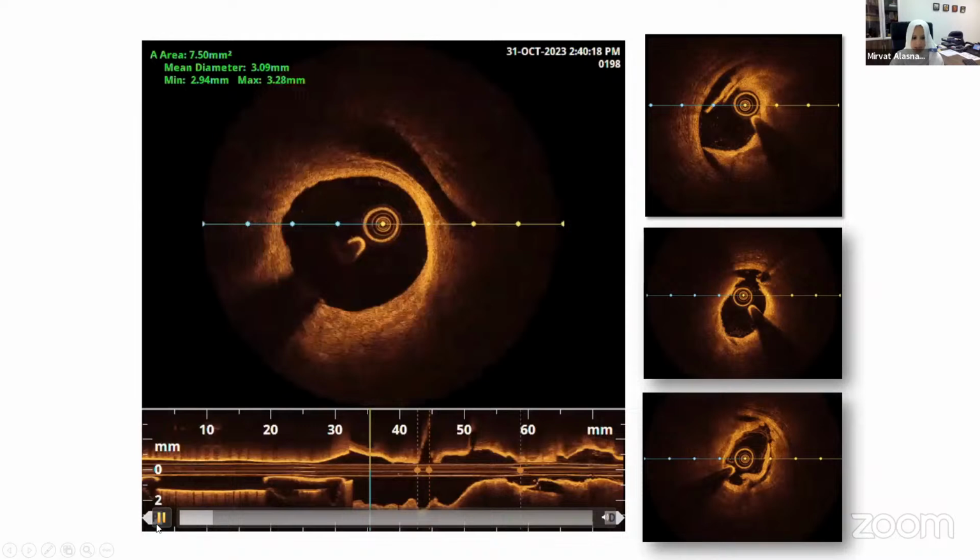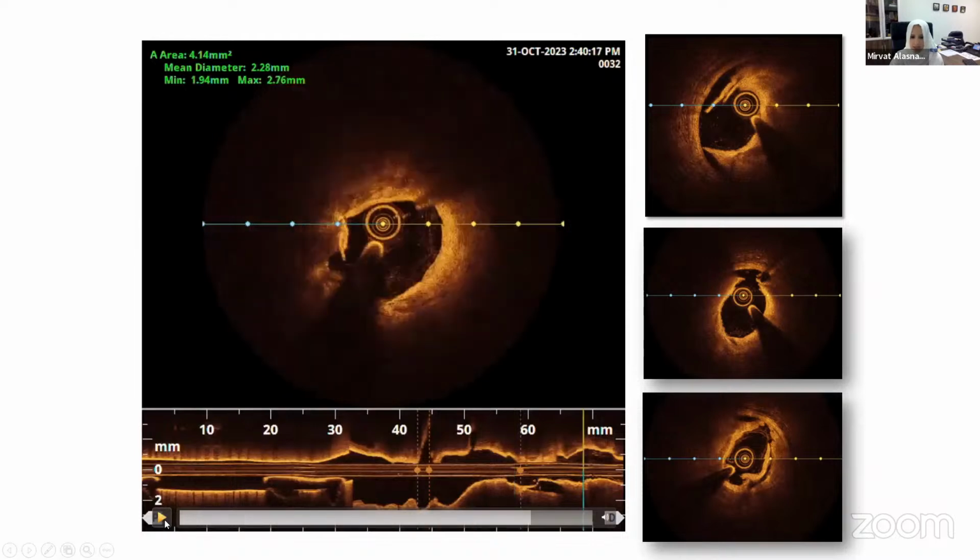But before stenting, we need to do an intravascular ultrasound run, OCT run. And what I want to show you here is the top one actually shows you that there's dissection, right? And it's facing 9 o'clock. But you see that it's quite extensive. If we had pushed it any more, it would have been deeper. You look at the middle segment, again, that shows us that we've done adequate modification, but it's actually quite a deep segment that we ended up getting a fracture in it.